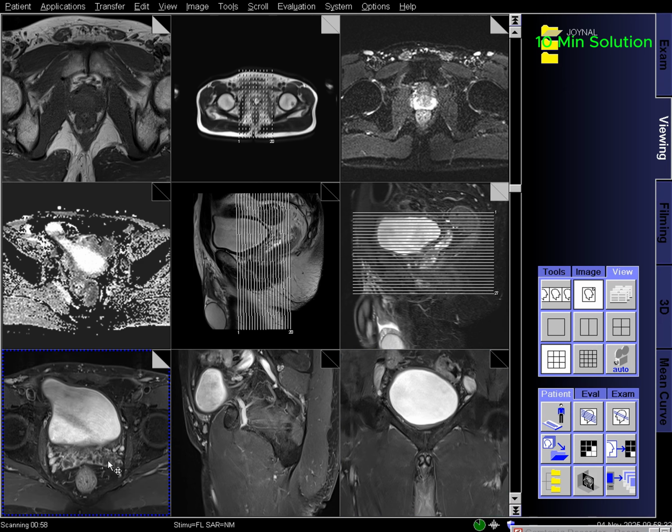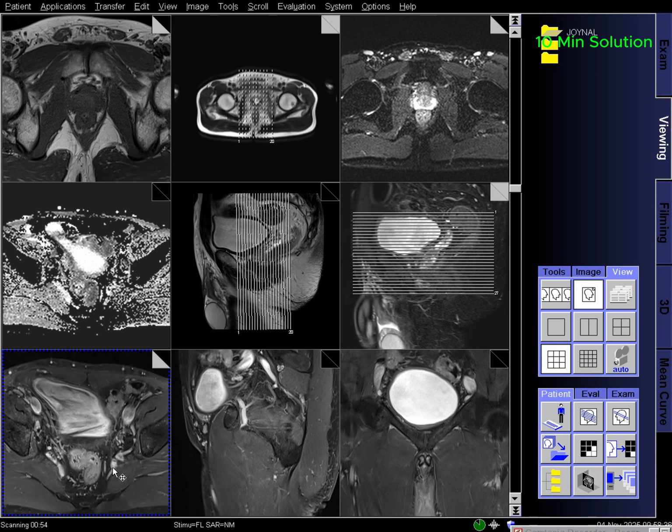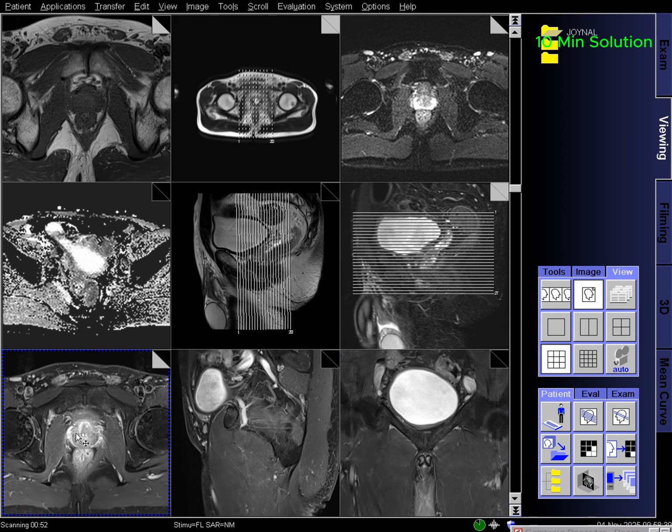Additionally, to minimize artifacts arising from arterial pulsation, peristalsis, and breathing, consider incorporating saturation bands on top and in front of the axial block.